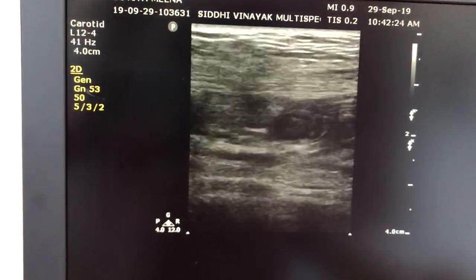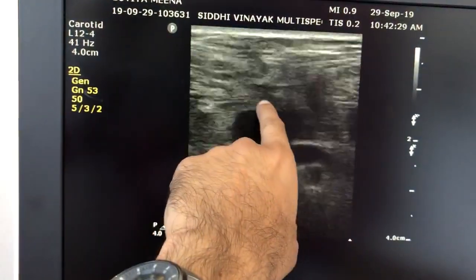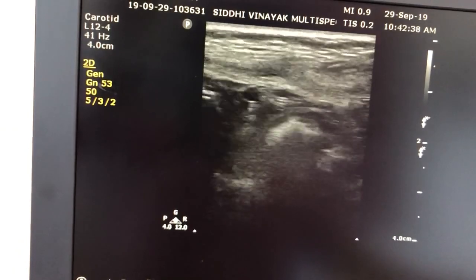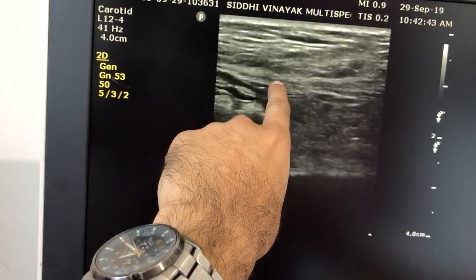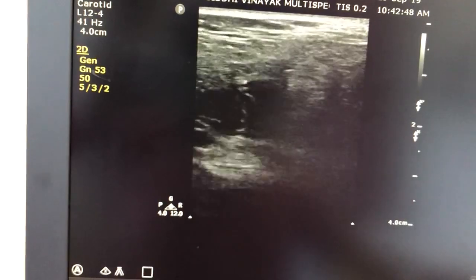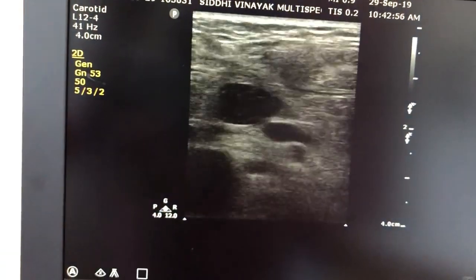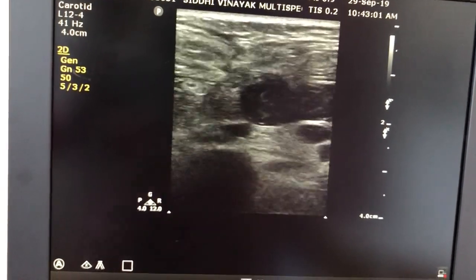Now, if you take the longitudinal section, this is what we say is the linea alba. If you take the longitudinal view and go on tracing inferiorly, here this is the linea alba, and it is further here not seen. Here is the site of the herniation defect. These bowel loops are a little bit hypoechoic, it could be gangrenous, but we cannot evaluate that on USG.